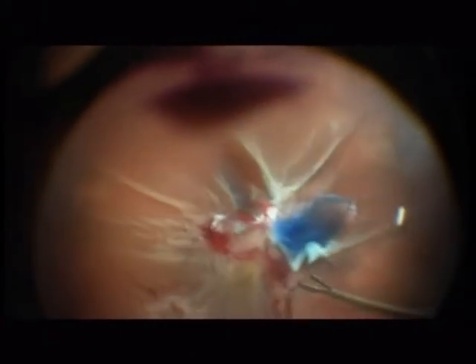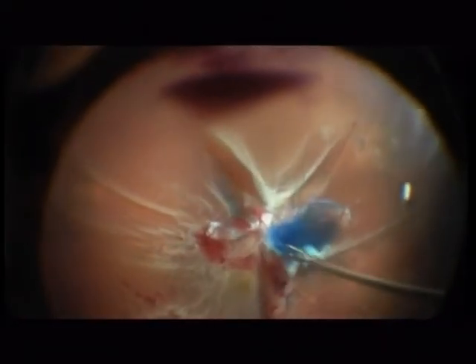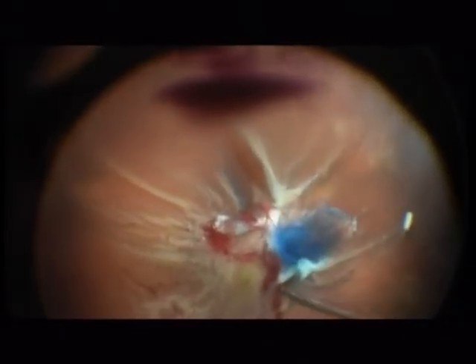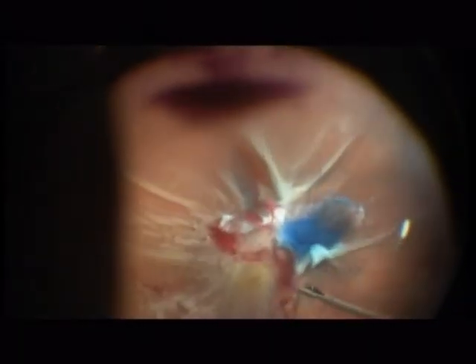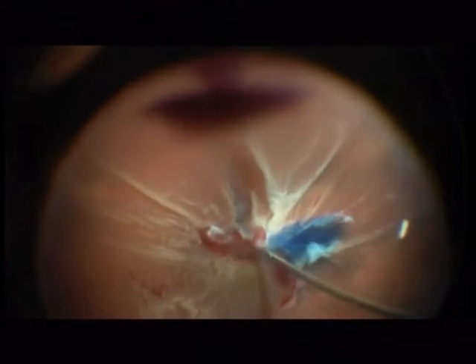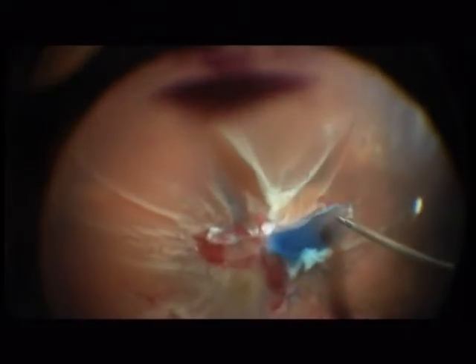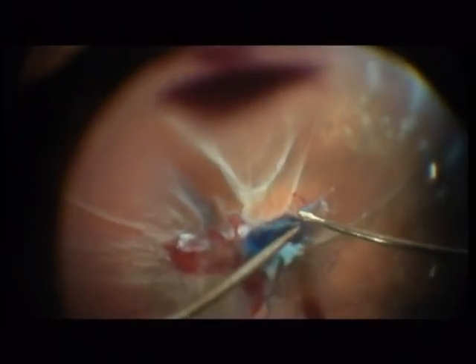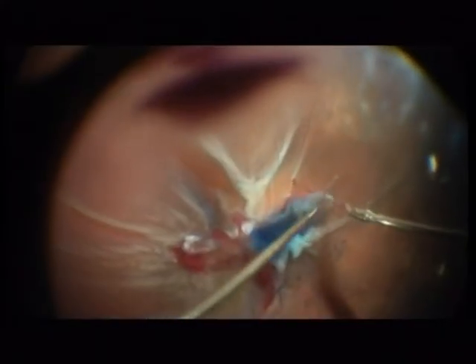Now let's move to this very thick membrane, which is very firmly attached to the underlying retina. This is a thickened posterior hyaloid. For these eyes you need patience, and I recommend general anesthesia. You see that there is a retinal rupture here, which is caused from the removal of this thick membrane. I am trying to remove the traction so that I do not enlarge this rupture.